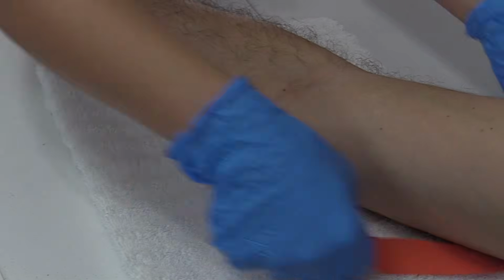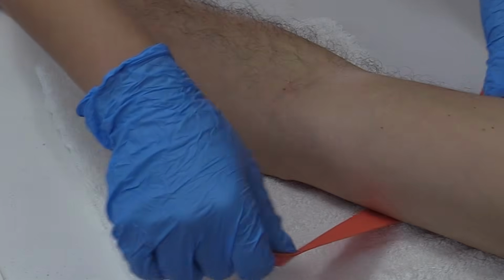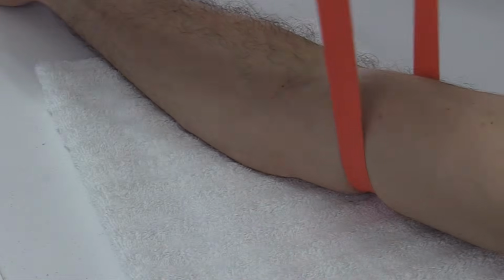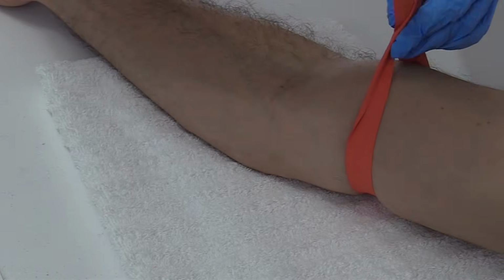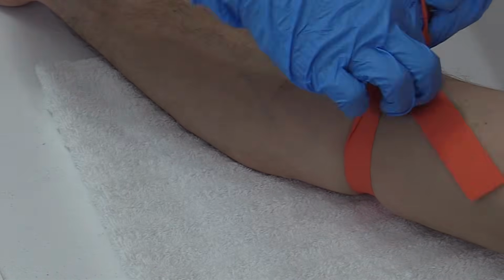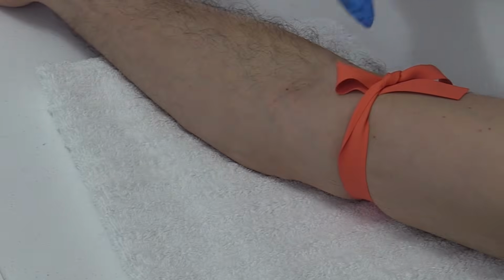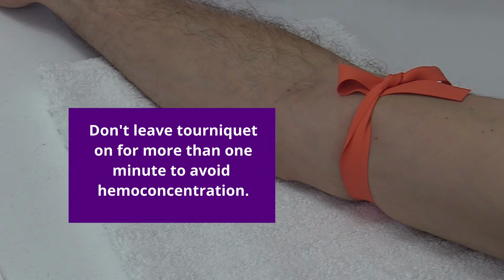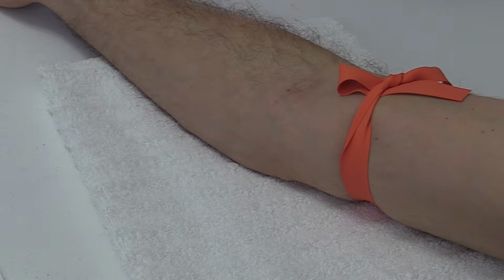So what I'm going to do is I'm going to put the tourniquet on about 3 to 4 inches above the insertion site. I'm going to take this, put some tension on those ends, and then I'm going to make an X like I'm crossing a shoelace. Then I'm going to take one of these ends of the flaps and just put it halfway so I can have a quick release. Now I don't want to leave this tourniquet on more than a minute because it could alter the lab results, cause hemoconcentration, and if I forgot and left it on more than a minute, I could take it off, wait 2 minutes, and then reapply.